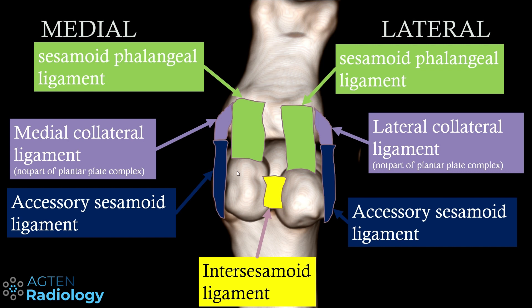Moving on to probably the most important structure: the sesamoid phalangeal ligaments. You have the sesamoid on the medial side and lateral side, and from the distal pole of both sesamoids there is one ligament — or rather an enforcement or focal thickening of the plantar plate — running from the distal pole down to the plantar base of the proximal phalanx. That's the sesamoid phalangeal ligament, and you've got one on each side.